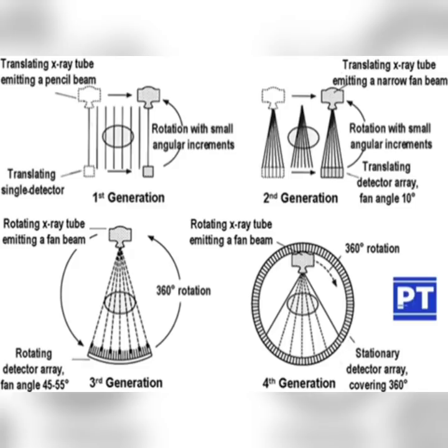It is otherwise known as conventional CT since it has a cable connection. So continuous rotation of the tube detector system is not possible in a third generation CT. While moving on to the fourth generation, you can see an array of detectors with the X-ray tube inside the detector ring, and the X-ray tube is rotating, so it is known as rotate stationary.